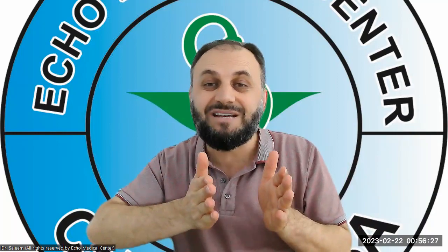Maybe you send these images to somewhere else, and the reading doctor, or a next doctor who is going to see your patient some other time, may have no idea, because they were not with you when you were scanning the patient, so they don't know which type of flow. So it's better not to take pulse wave Doppler in the bulbous area. It's my suggestion. You apply your protocol, but I'm just telling you the reason for that.